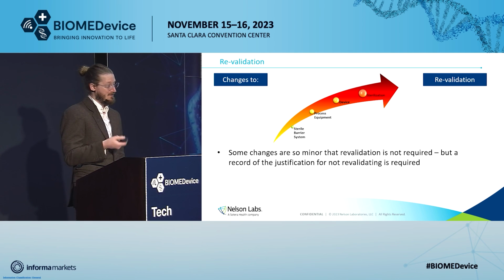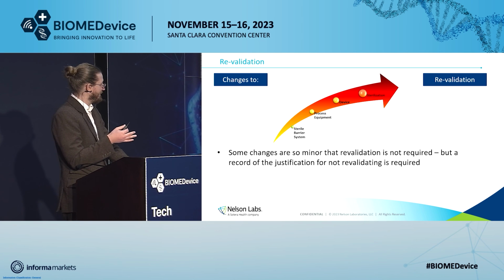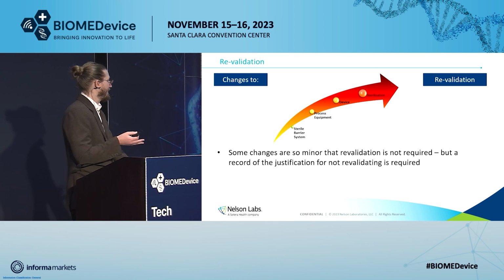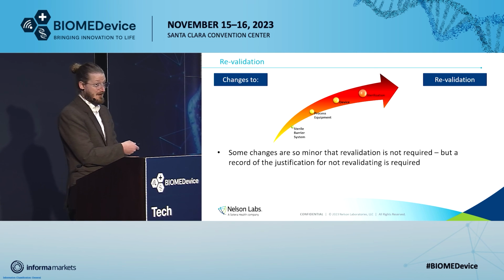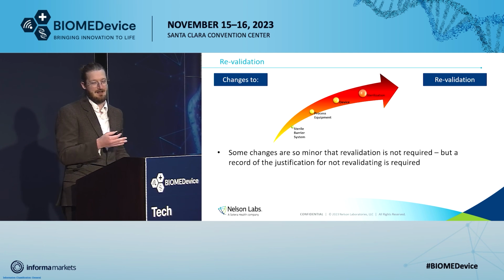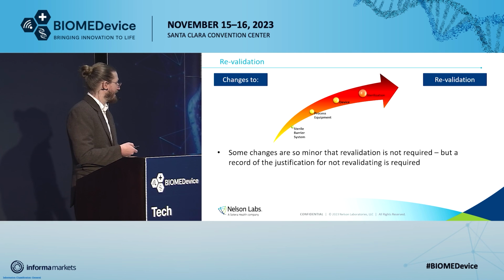So the other thing to keep in mind in the whole conversation of, if you're looking to be more sustainable, economical, and you're thinking about maybe using post-consumer material or you're changing your material, changing those things requires a revalidation of your sterile barrier system. So if you change the sterile barrier system itself, right, you need to revalidate. If something in your process changes that impacts it, you need to revalidate. Same with if you're changing your device or your sterilization method. Any of those changes would necessitate a revalidation of your packaging.